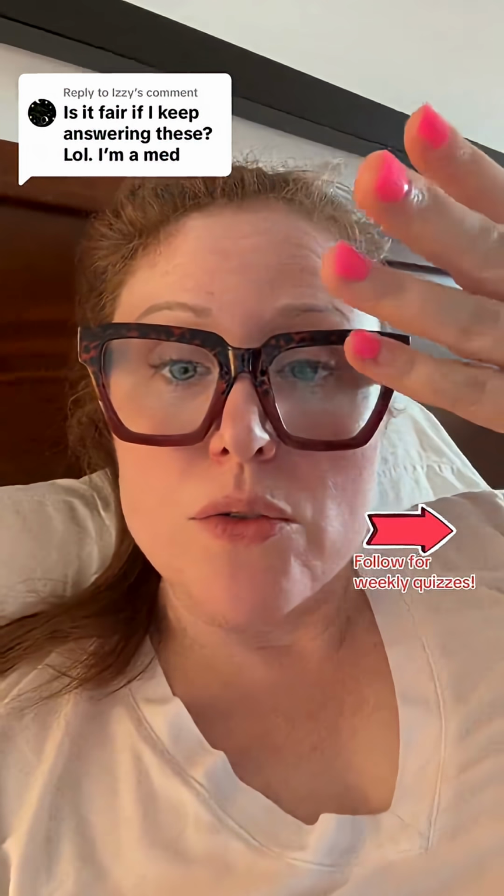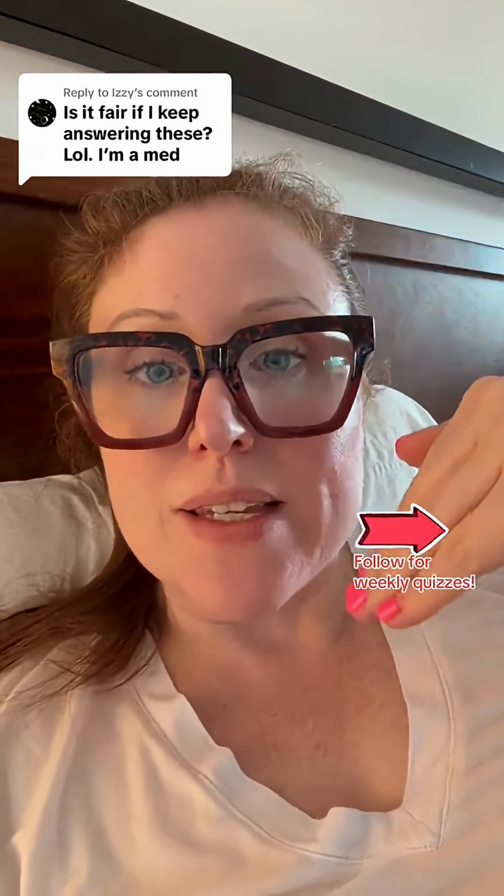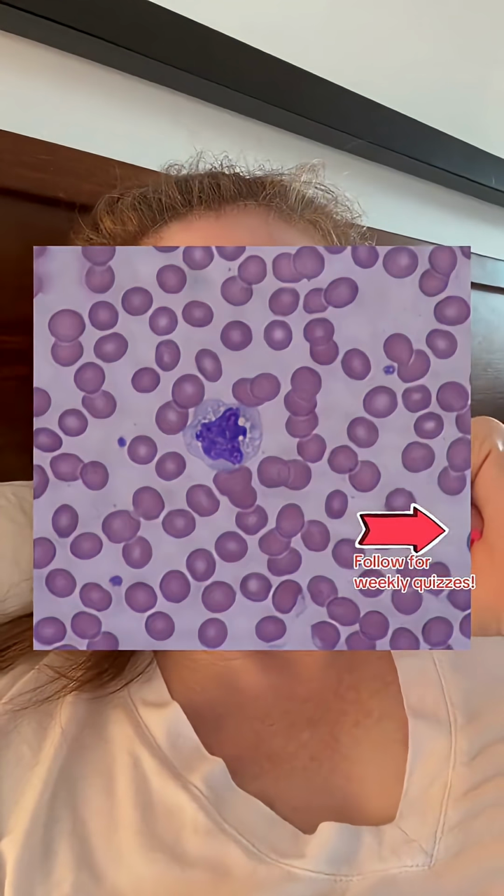The way I learned to describe and identify blood cells was by taking it step by step until it becomes reflexive. This is the cell that we were tasked to identify on the last blood smear quiz. The first thing I start with is size. What is the size of this cell in comparison to the reference cell, which almost always is going to be the surrounding red blood cells.